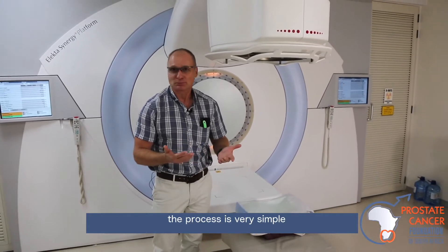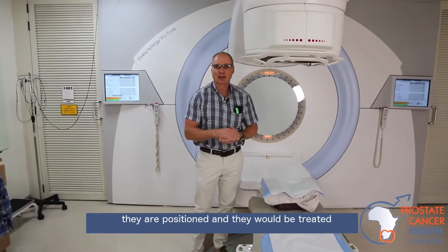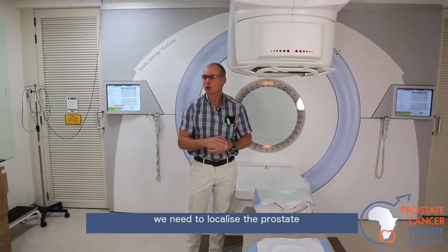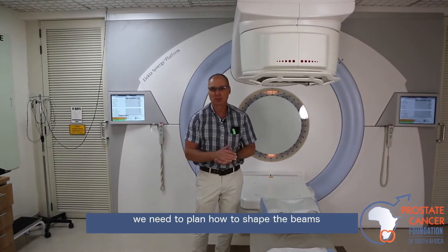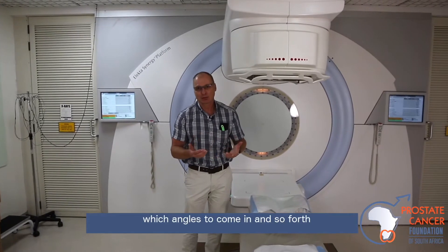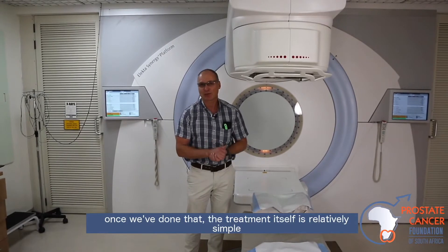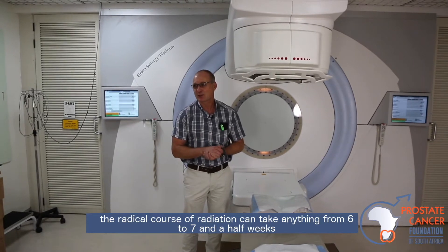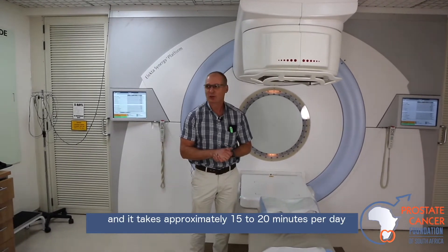The process is very simple. The patient lies on the bed, they're positioned, and they would be treated. The planning beforehand takes some time — we need to localize the prostate, plan how to get there, shape the beams, and decide which angles to come in. But once we've done that, the treatment itself is relatively simple. The radical course of radiation can take anything from 6 to 7 and a half weeks of daily treatment, 5 days a week, and takes approximately 15 to 20 minutes per day.